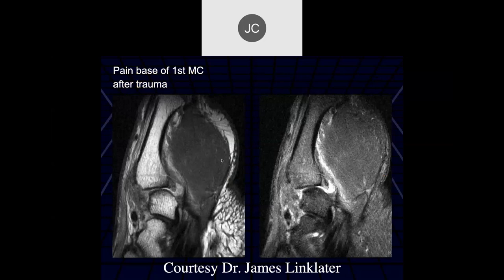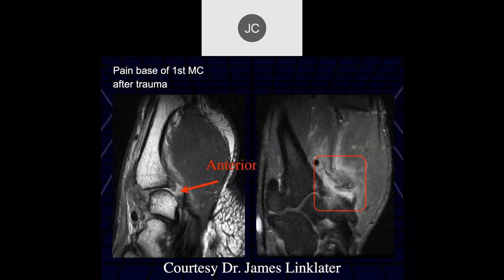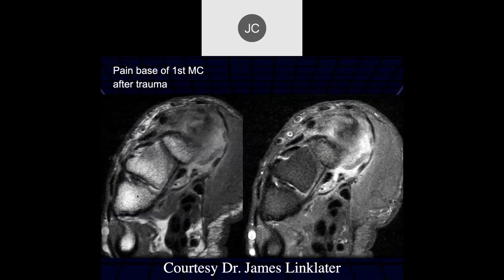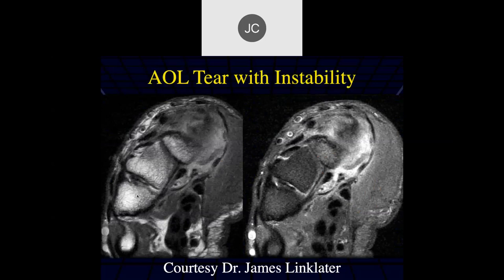Robert: pain at the first metacarpal base after trauma. There's a lot of edema surrounding the first CMC, and there looks like there's a tear of the anterior oblique ligament. That posterior ligament doesn't look great either. This was a severe injury with a complete tear of the anterior oblique ligament — probably someone who had an acute dislocation.